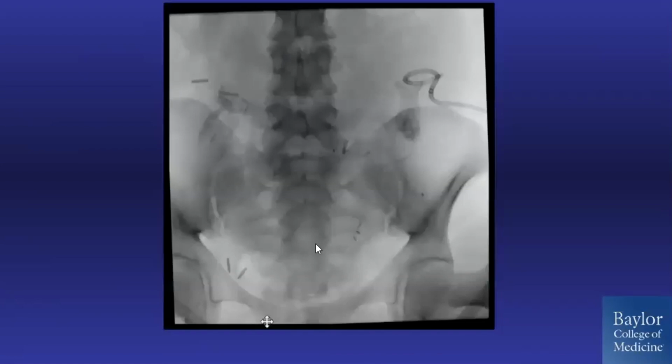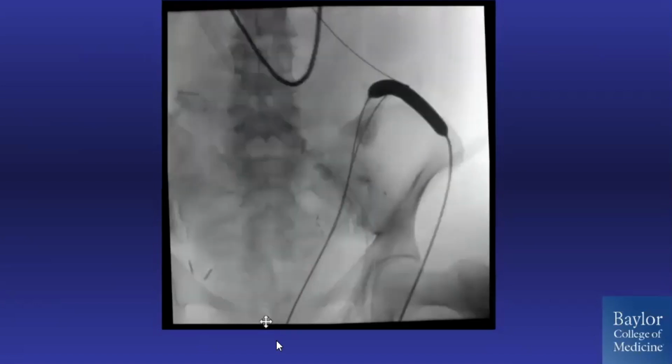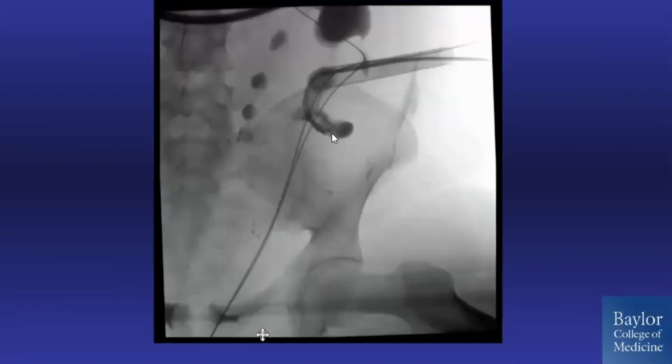So we start by clearing the bladder fragment with cystolithopaxy, get our percutaneous access, and then start a percutaneous nephrolithotomy, get our through-and-through access to facilitate everything. Dilate, careful with our torque. This is the kidney kind of end-on looking at us, clean it all out. Look, there's still a filling defect. So we need to check that out with our flexible instrumentation, just like you would for a percutaneous case.